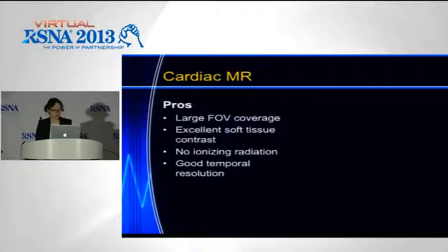We'll compare that to MR, where soft tissue contrast is its major strength. There's no ionizing radiation. We have good temporal resolution, and those two factors combined mean that we can get a very good functional assessment. We can assess mass mobility and effect on the heart as well.